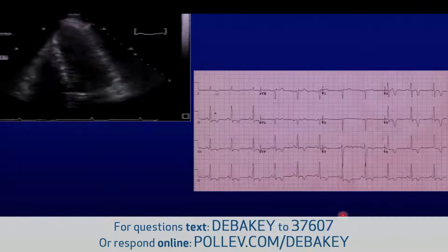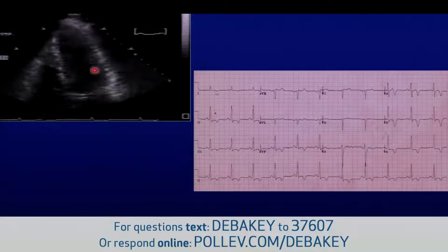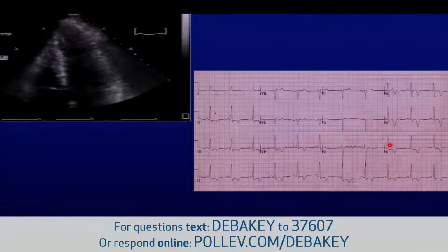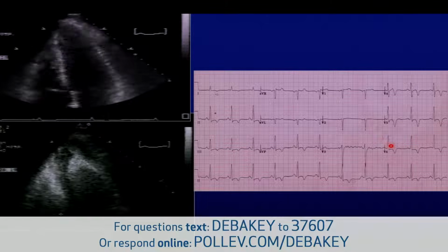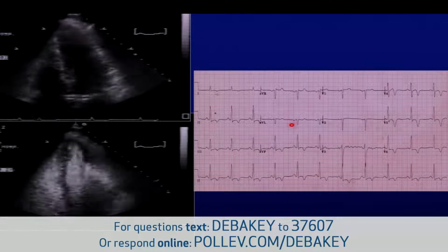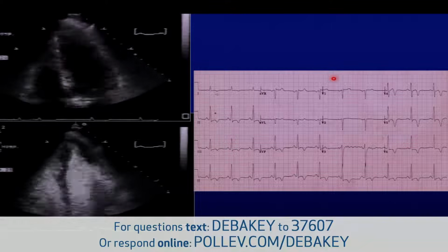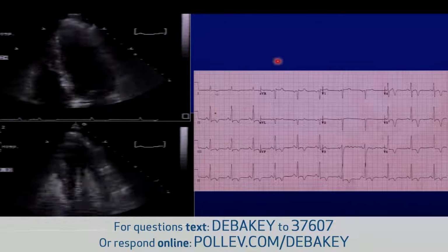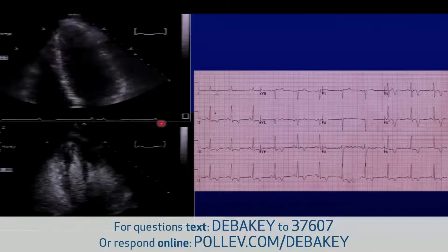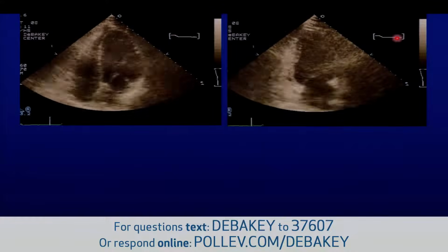And if you take a look at the baseline echocardiogram, you cannot really tell whether there's an apical abnormality where you could have an apical ischemic defect, yes or no. And it turns out to actually be the apical variety of HCM. Not even a sequestration of an apical cavity, but the ace of spades is very prominent here, and it turns out to be an apical hypertrophic cardiomyopathy.